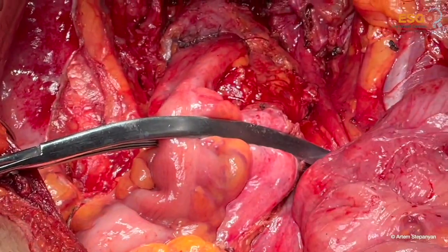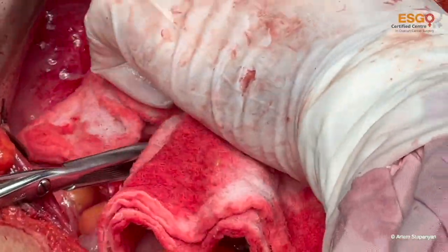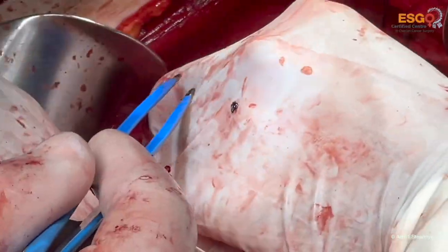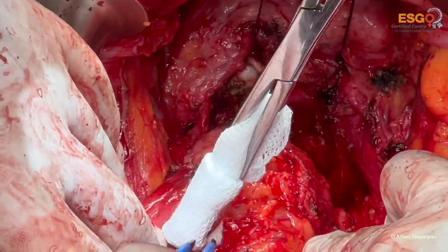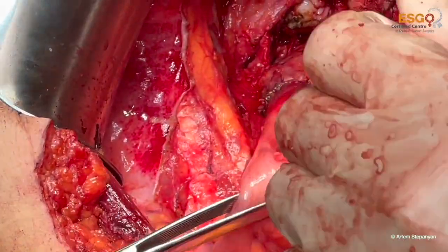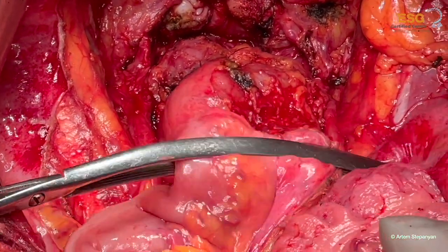Now we close the proximal bowel and inject the betadine and do the bubble test. We see the betadine test is negative. There is no small hole. Otherwise, we will see the betadine leaking away from the bowel. We can use the blue dye also for this, but we prefer to use the betadine. Here we see that there is no betadine leak.